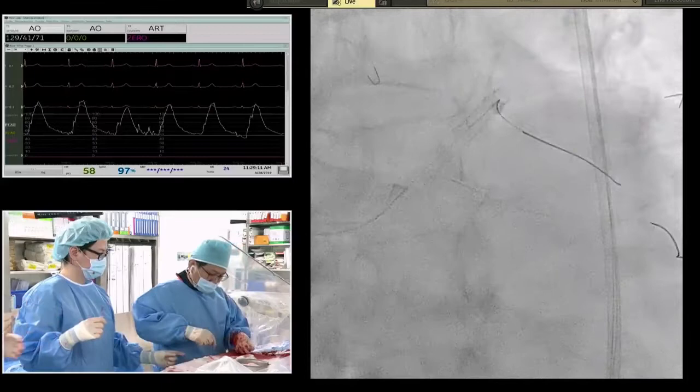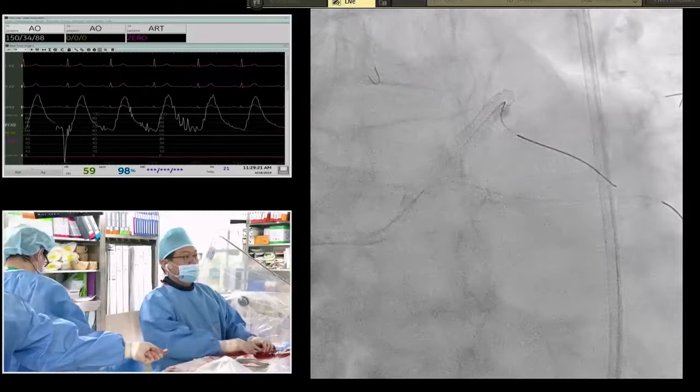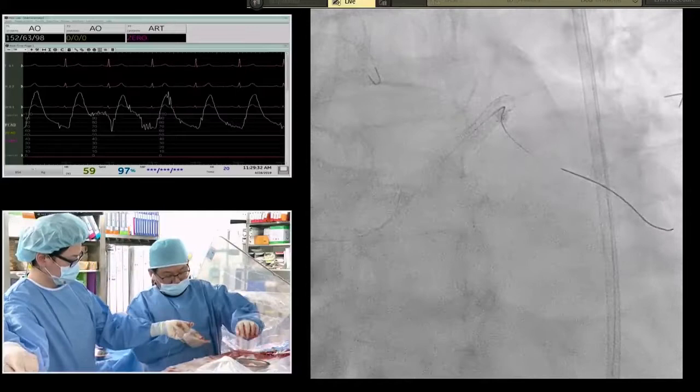But if after treating the left main, FFR is acceptable, or if we look at the IVUS and see that the lumen area within the Cypher stent is acceptable, I would leave it alone. Yeah. The circumflex wire is not necessary. I mean, so I'm removing it.